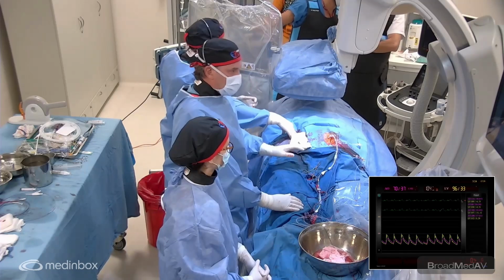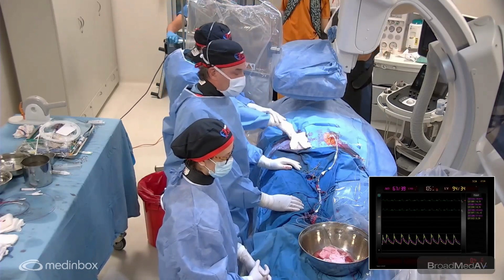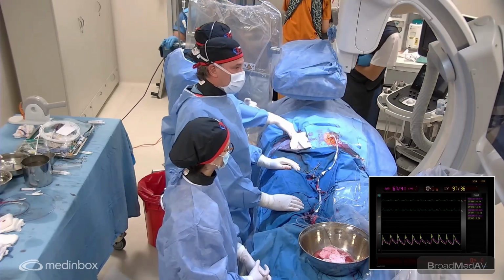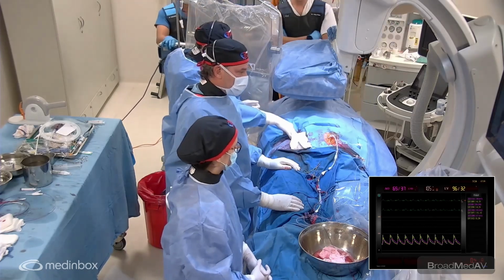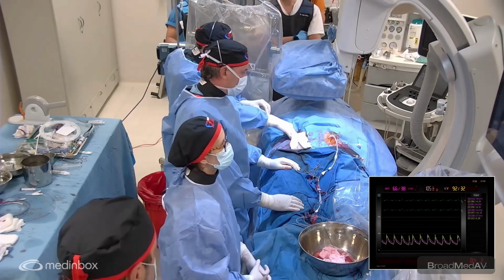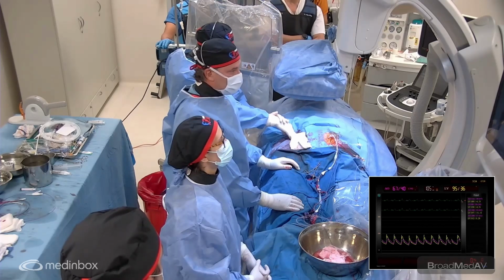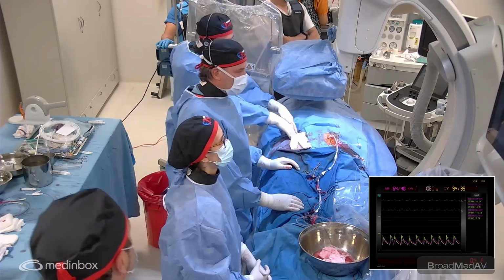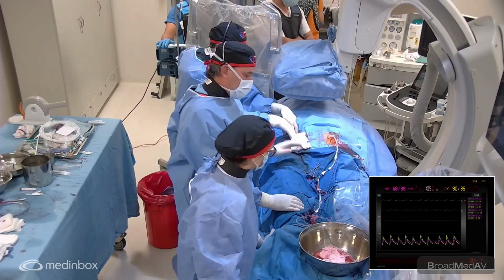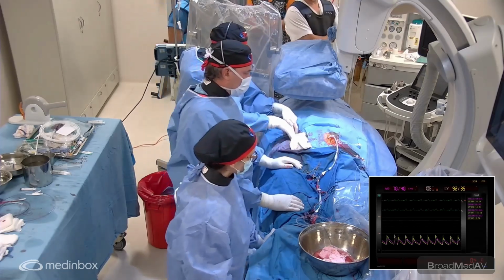If it disappears completely, we can probably leave the pacemaker on the right ventricle for probably 12 hours more, until tomorrow afternoon. And then we can decide if we can pull it or not. But this is a patient that is not going to go home tomorrow for sure. It's a patient who should be here in the hospital at least 2 or 3 days, because something that can revert can appear again 1 or 2 days after the procedure.